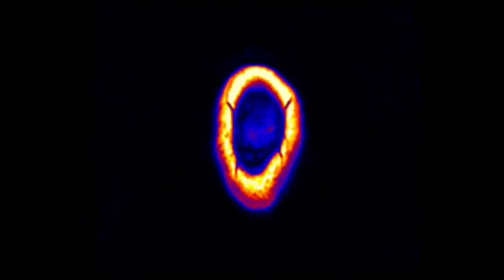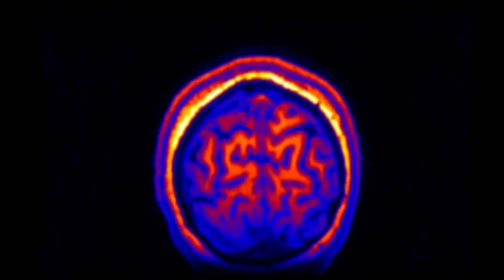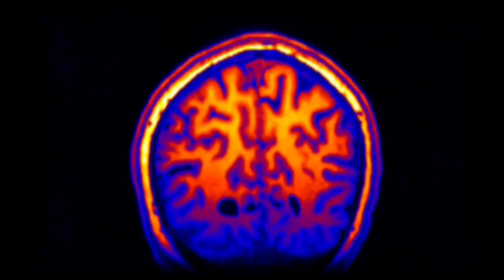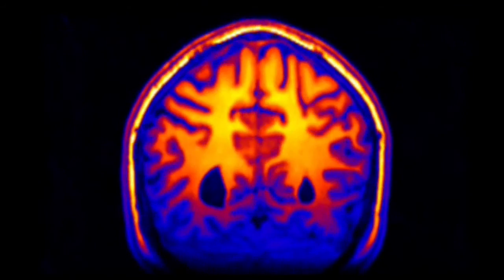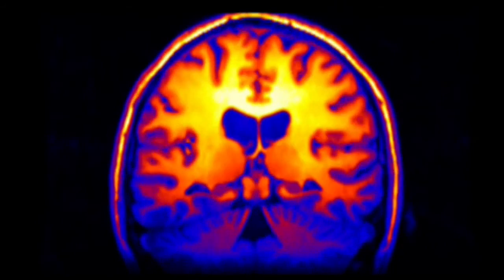As expected, a large amount of data is generated by these sensors. This data needs to be parsed, analyzed, and rendered in order to be in a useful format for the doctors and radiologists to look at. This is where software comes into play.